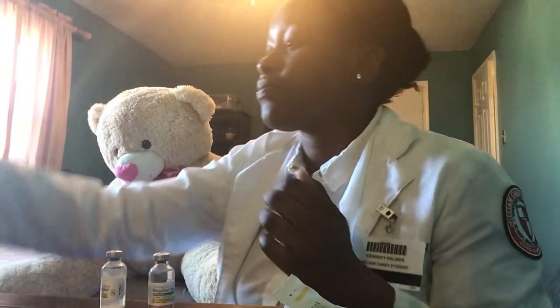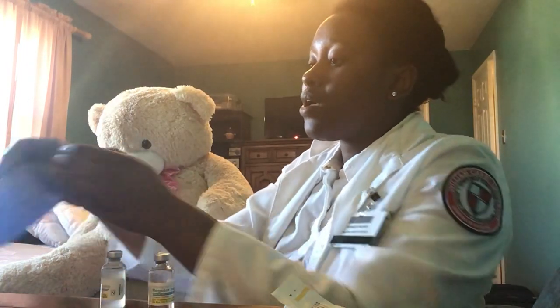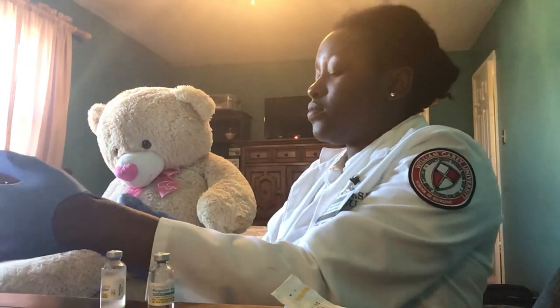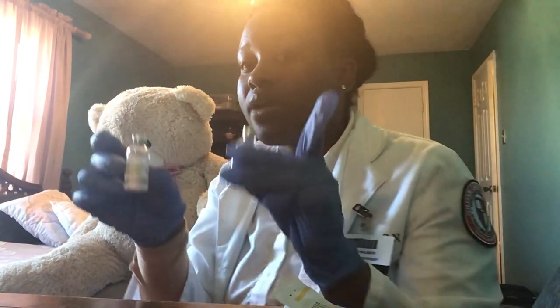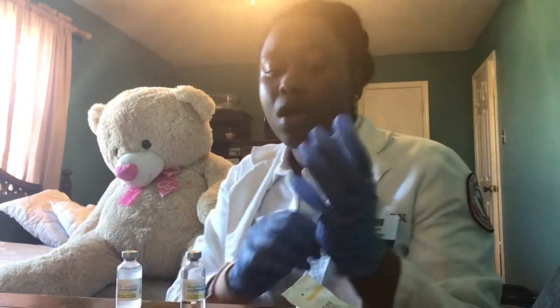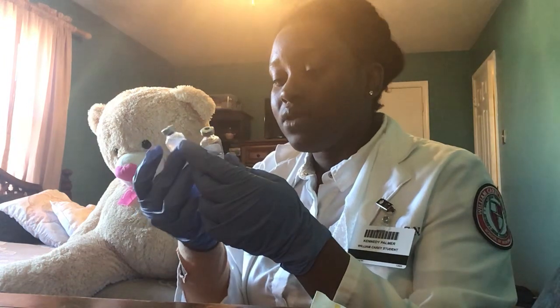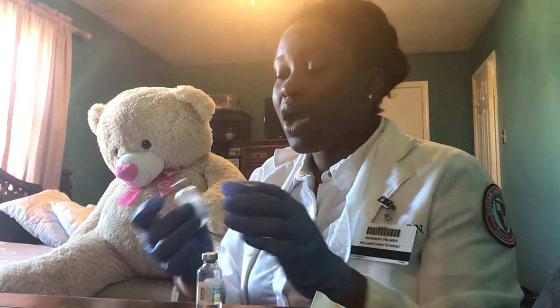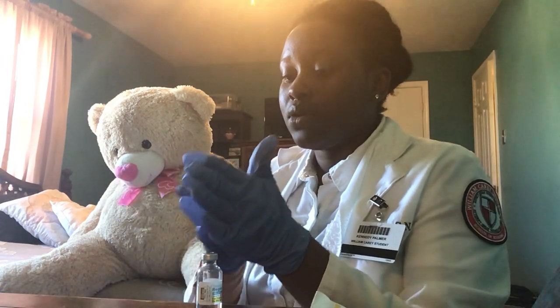I'm going to perform hand hygiene, and I am going to don clean gloves. I have my medication, NPH and regular. I'm going to verify the physician's orders with the MAR again, and I'm going to check the expiration date on the medication. I am going to lightly roll each medication in my hand.